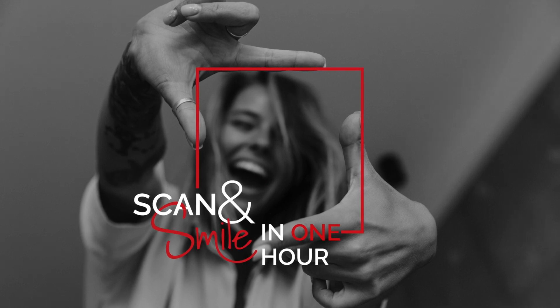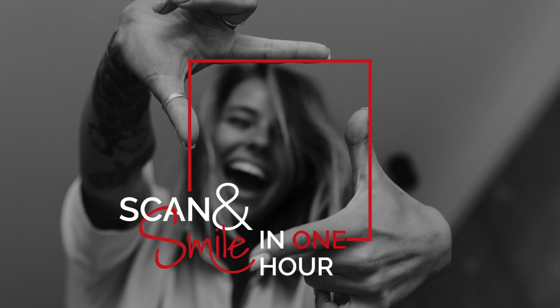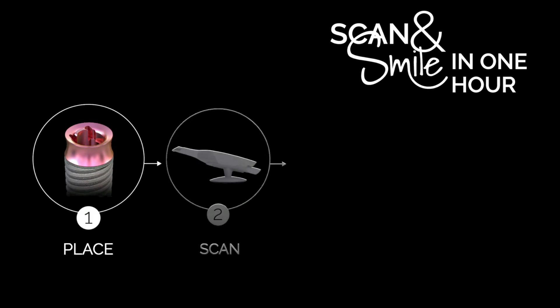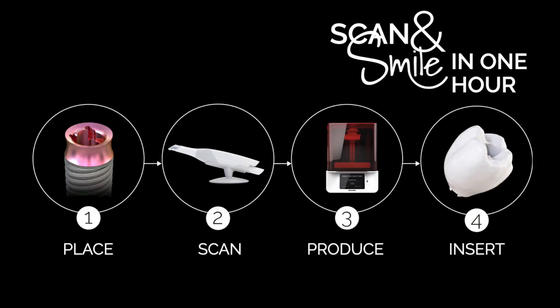The Scan and Smile solution from TRI guarantees the fastest and simplest implant smile in the world. With the Scan and Smile solution, you can place, scan, produce, and insert the prosthetic crown in one hour.